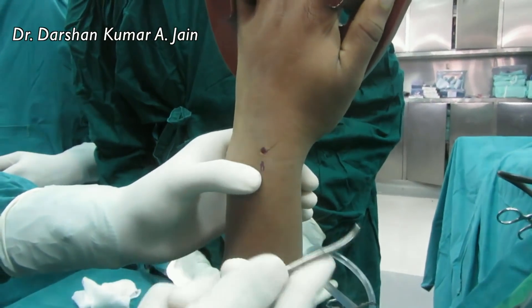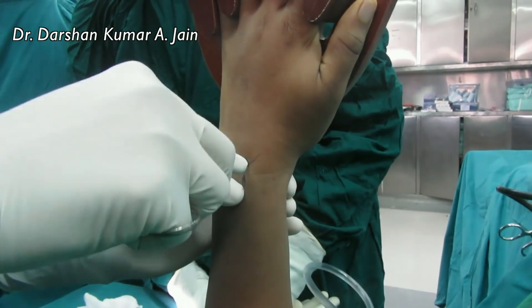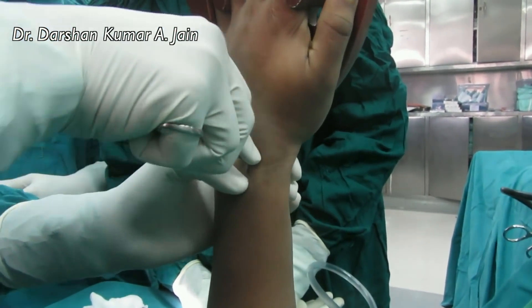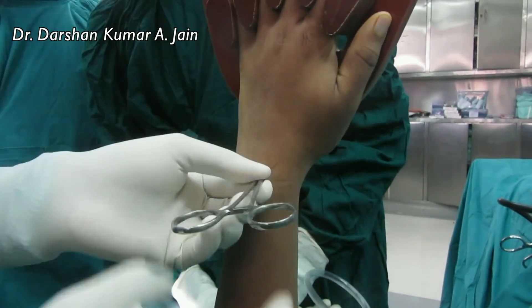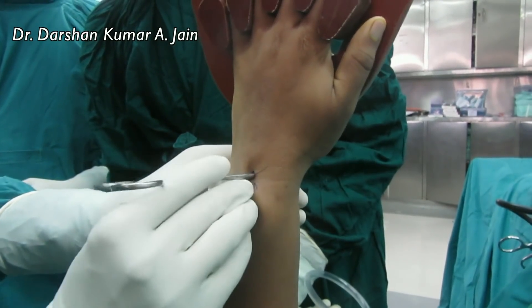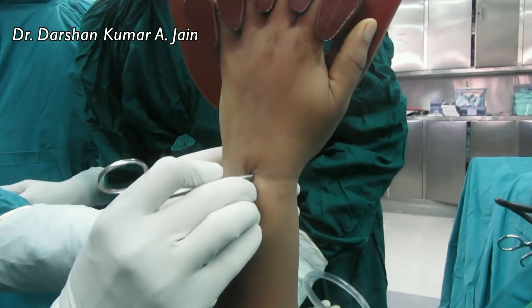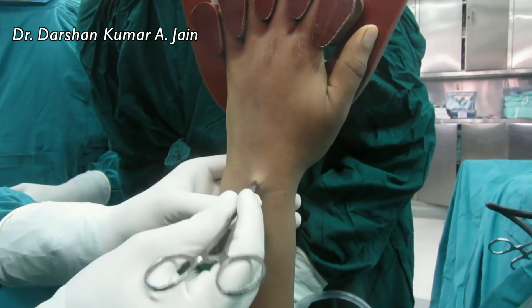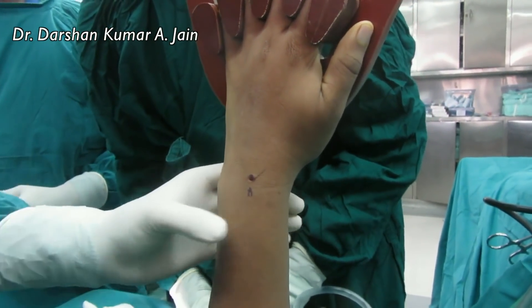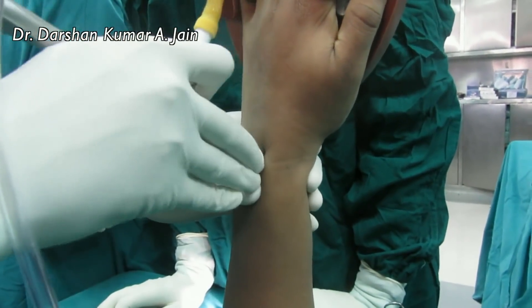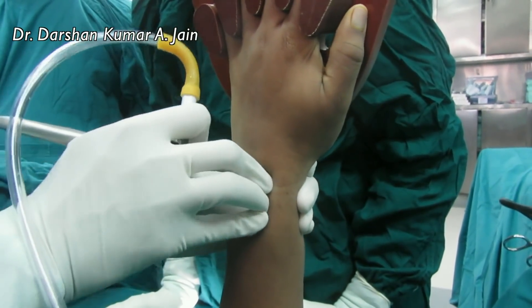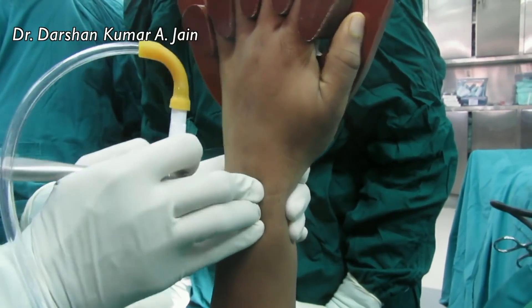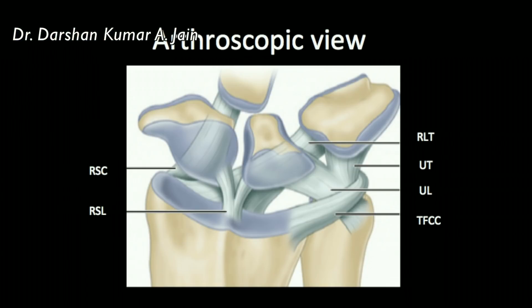A blunt hemostat is used and entered into the radiocarpal joint just distal to the Lister's tubercle. A 2.4 scope is commonly used for wrist arthroscopy. Access is gained into the radiocarpal joint and this is the view inside the joint.